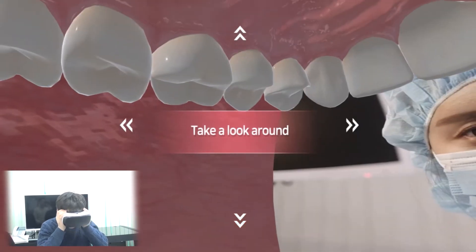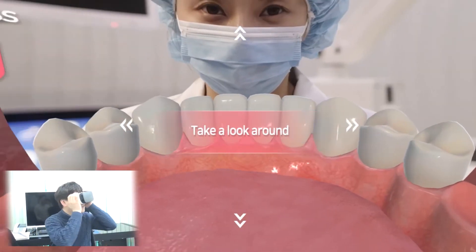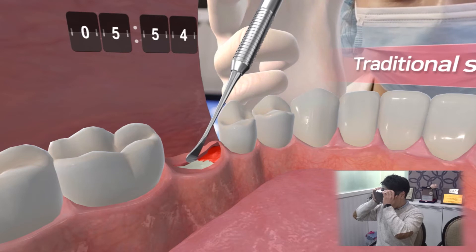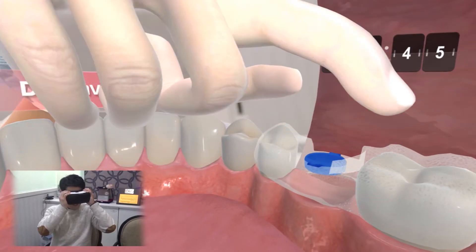Dental implant surgery today. First, let's take a look inside the mouth area. Here comes the knife to make an incision in the gum — cutting through to the bone is not an easy process. A customized surgical guide fits inside the mouth.